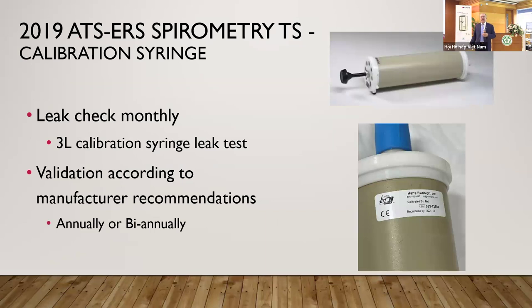So that calibrating device needs to be accurate itself, right? And so the technical standards say that the accuracy of that 3-liter syringe needs to be validated periodically based off of the manufacturer's recommendation.